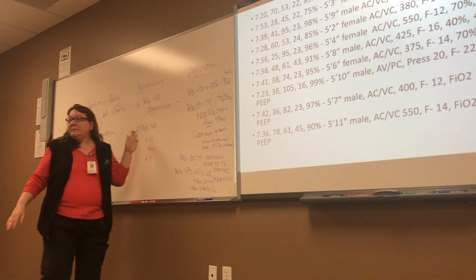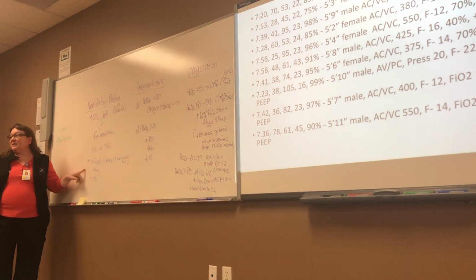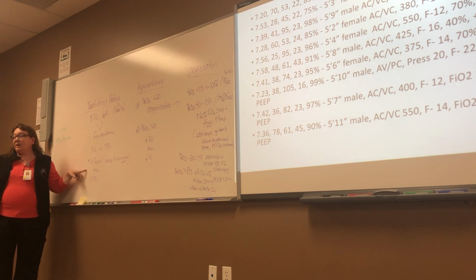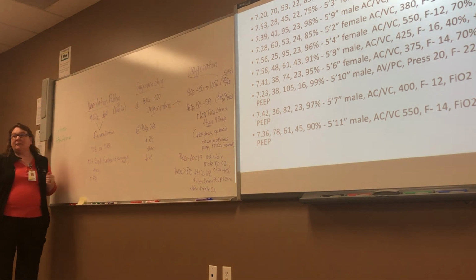So are we good now? Clinically, if your patient's CO2 is high, you're going to see people change the rate. That's why I said this is the only thing you'll see different, although volume has a bigger effect. Okay? Are we good? There it is, right there for you, all in one space.